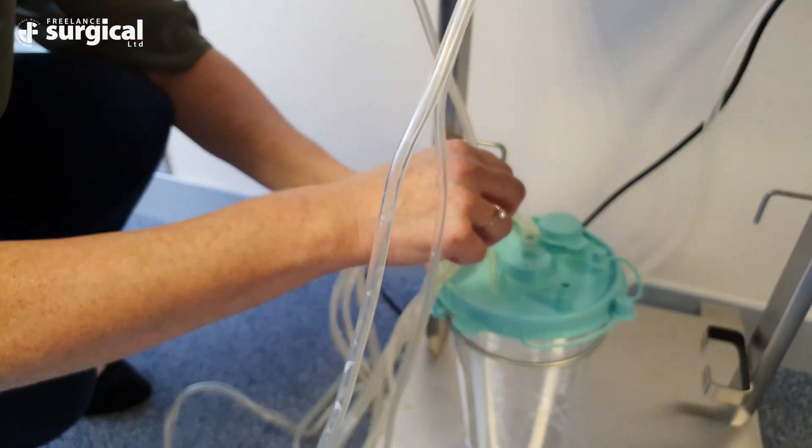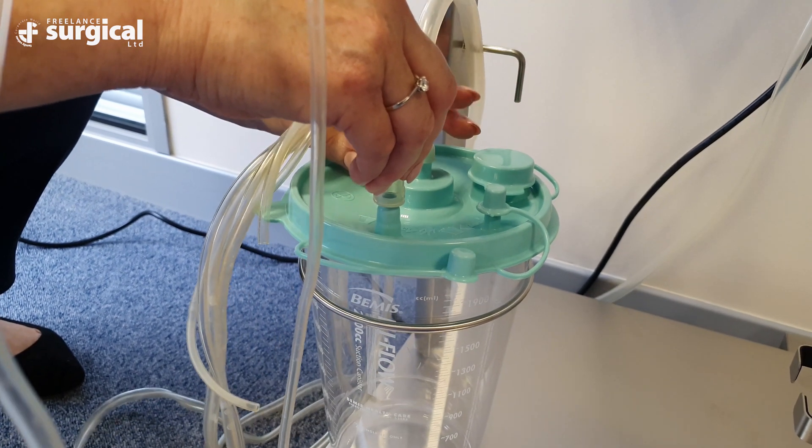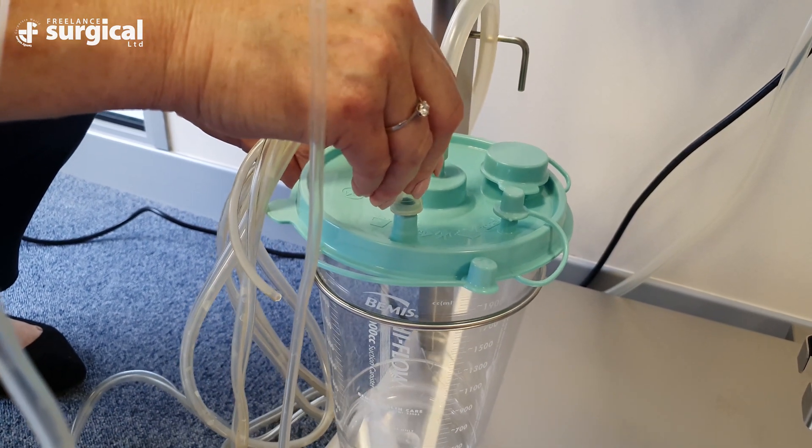When standby is selected, the white stopper pops out and crimps the tubing. The remaining tubes attach to the Sonicure handpiece.